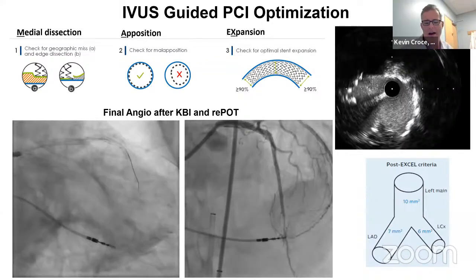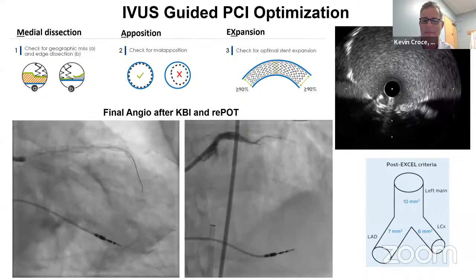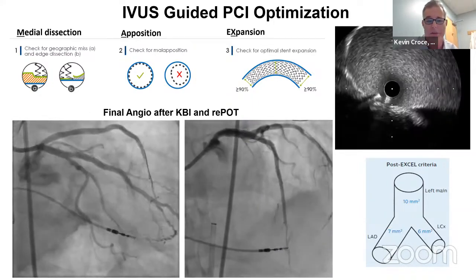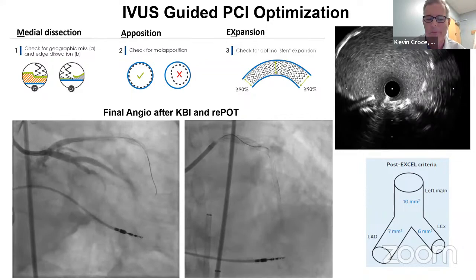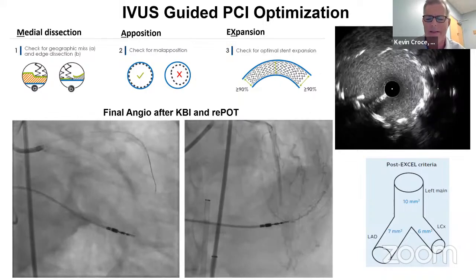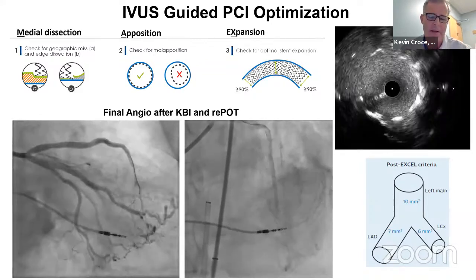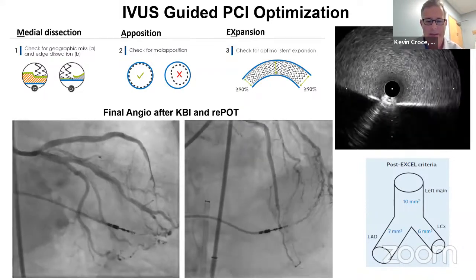Yeah, actually, the next case I'm going to show is an OCT-guided left main stent failure case. So it's a little bit more of MLD max as it applies to a complicated problem, which we're unfortunately seeing more often in our program. But happy to answer any questions of dealing with nodules. The particular nodule we saw in this case was not that big, was actually dealt with by the fact we'd gone around it. So luckily our expansion and dealing with it was fine. That's not always the case though, because we do have to do subintimal plaque modification with some frequency, which you have to be a little bit careful with because the subintimal space, although it's somewhat compliant, can be a little bit more likely to rupture if you go too aggressive with sizing or with aggressive devices.